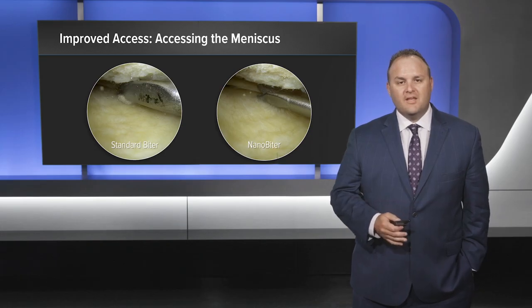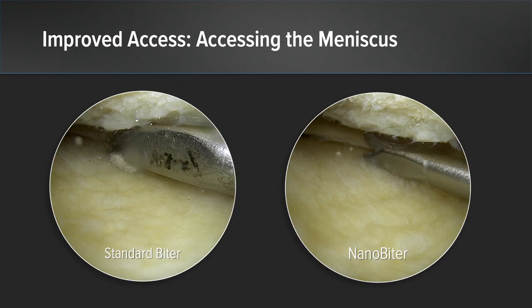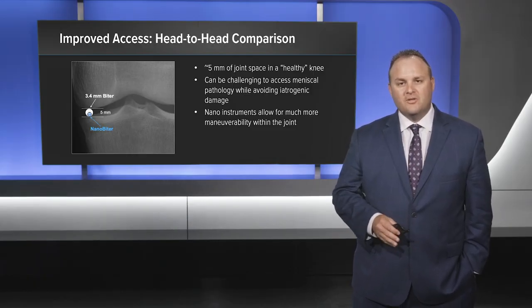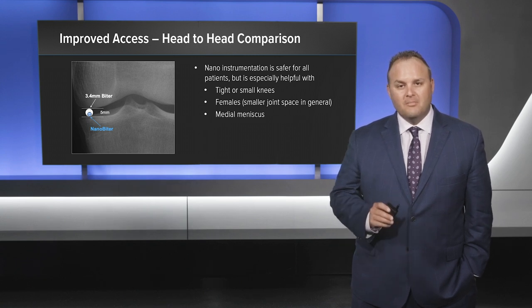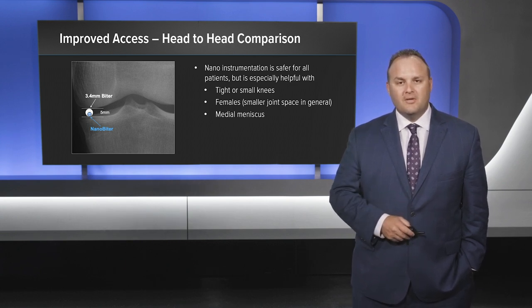Here you can see how the NanoBiter gives us improved access and instrumentation versus the standard biter, which is significantly larger. The standard joint space is around five millimeters, and nano instruments allow for much more maneuverability within the joint because of their size. You can see the comparison on screen: the 3.4 millimeter biter versus the standard nano biter. Nano instrumentation is safer for all patients but is especially helpful with tight or small knees, in addition to females and when working on the medial meniscus.